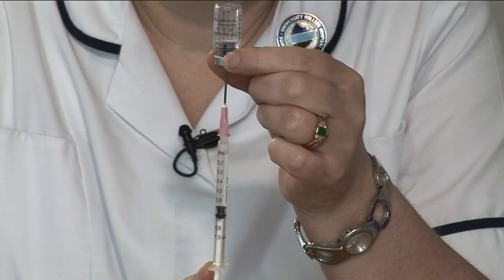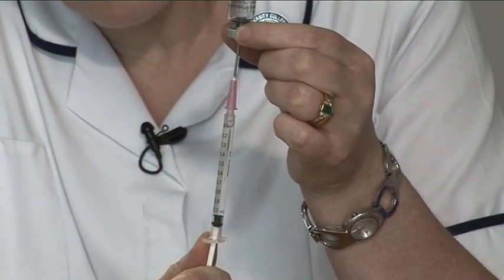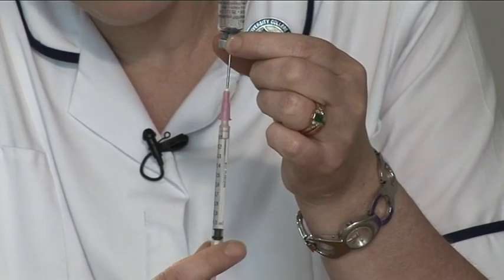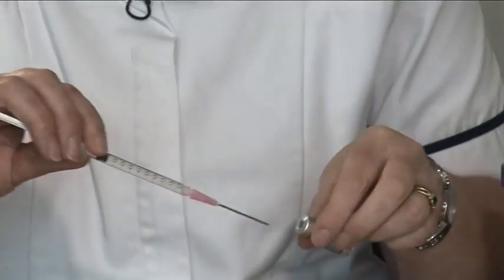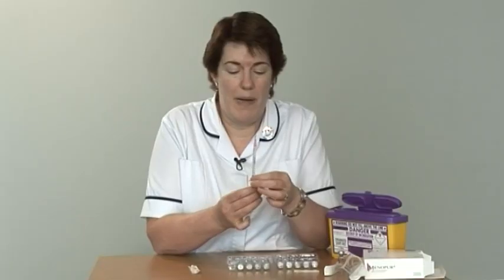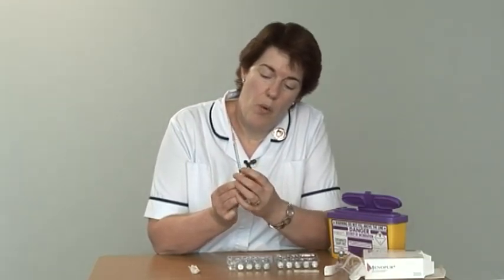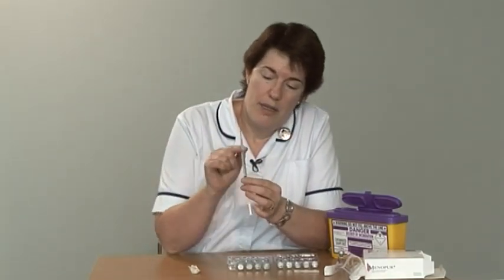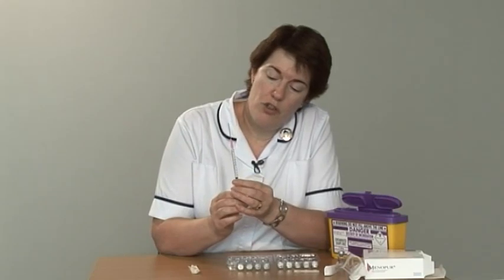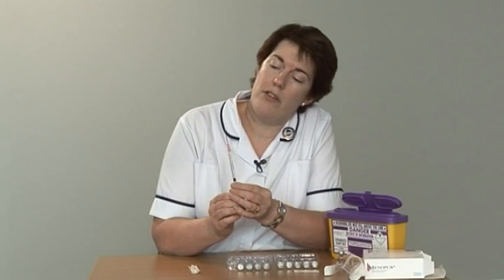Once you have sucked all the diluent out, you should have 1 ml of liquid in your syringe. The black top of the plunger should be level with the 1 ml mark on the syringe. If you've got air at the top of your syringe, you're just going to need to slowly squirt it out until you see a drop appear at the top of the syringe and needle.